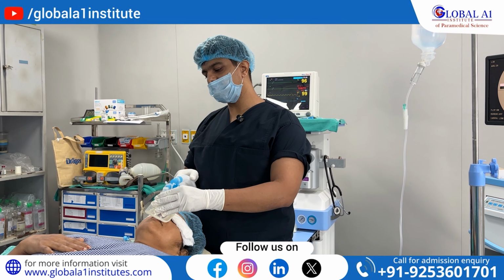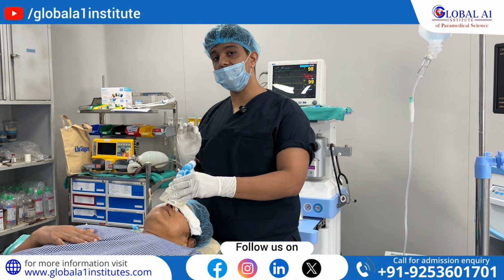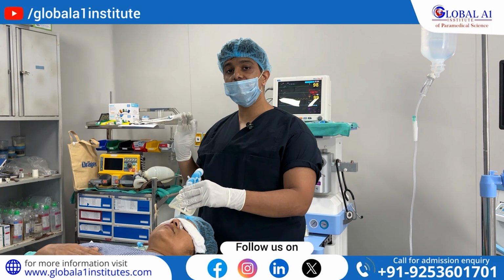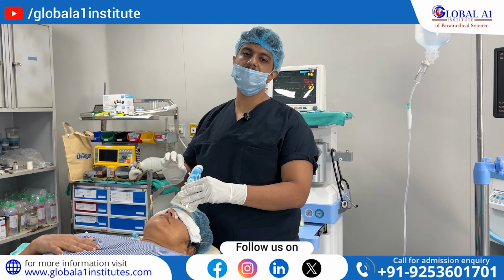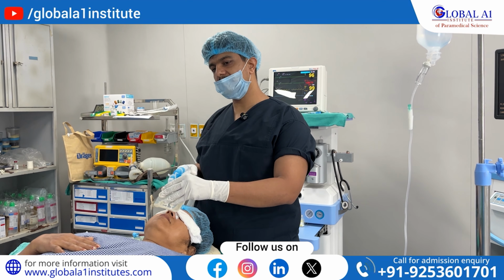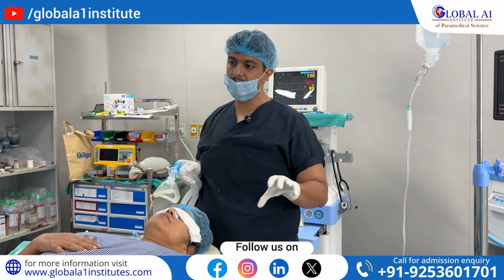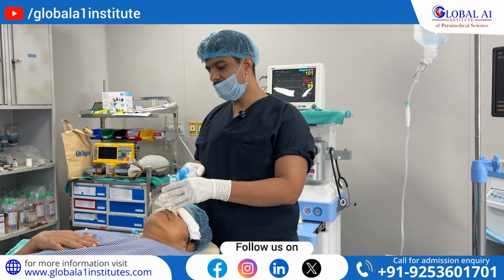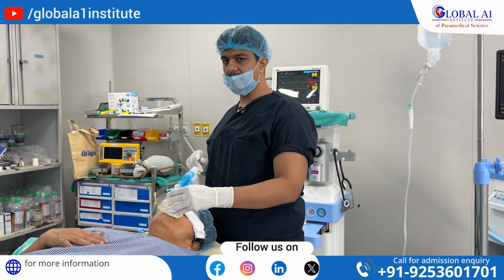The main aim of the pre-oxygenation is that if an individual who is not so experienced, or if we fail in intubation, we have ample time so that the patient doesn't desaturate, right? So we are just pre-oxygenating the patient. It is only in case of elective intubation, right? In ICU and in the anesthesia or OT setups, right? So we are starting with 100% pre-oxygenation for at least 3 minutes.